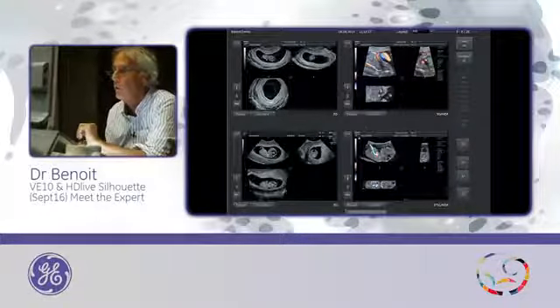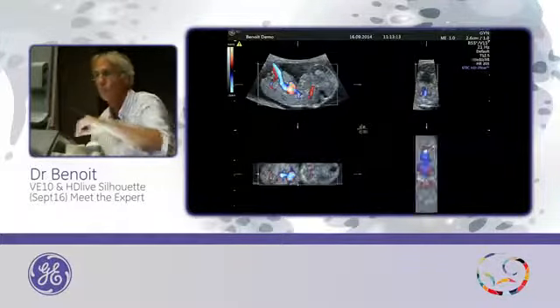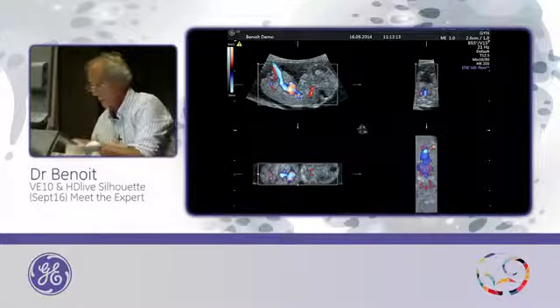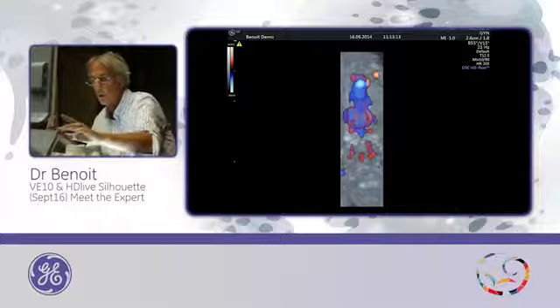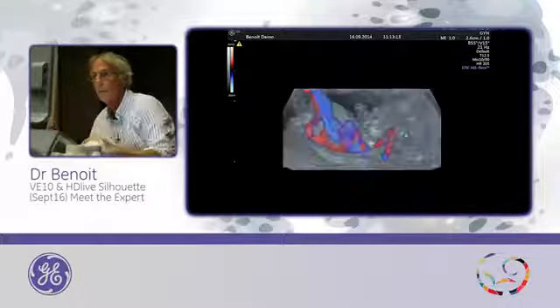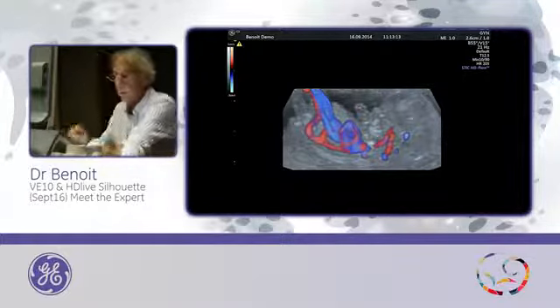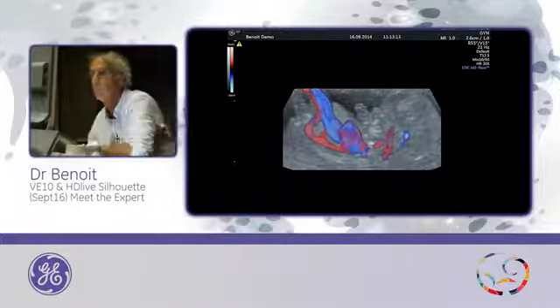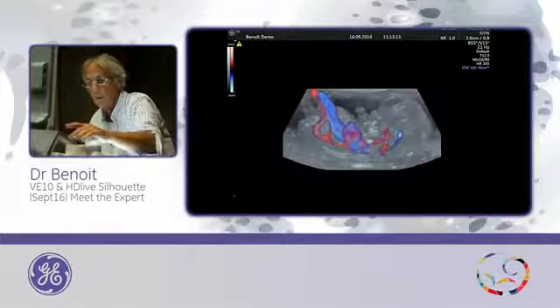And for this embryo, I did also this. This was a STIC acquisition with a color Doppler. So I change the position of the region of interest. So I have to go main, sub, this one. Because it was a STIC, I can activate and start movement. Reduce the size.